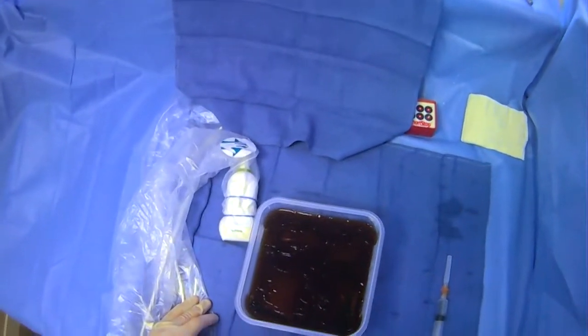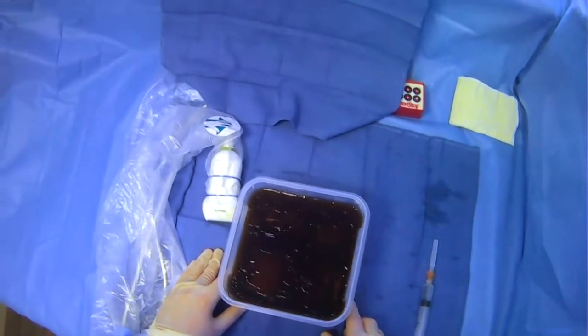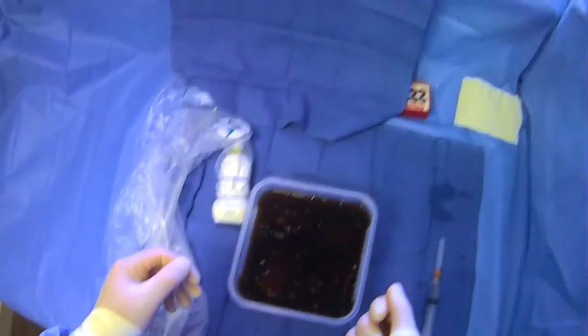In this video, we're going to go over how to give lidocaine for a paracentesis. This assumes that you've already scanned your region, you know how deep you need to go, you've made a skin wheal, a dermatotomy, and you're going to be numbing up the track leading up to where you're going to be draining the ascites.